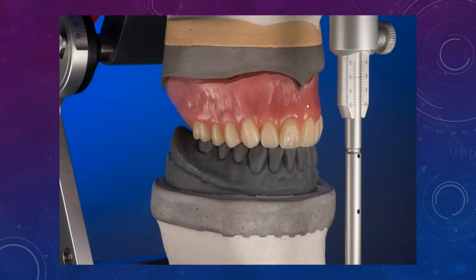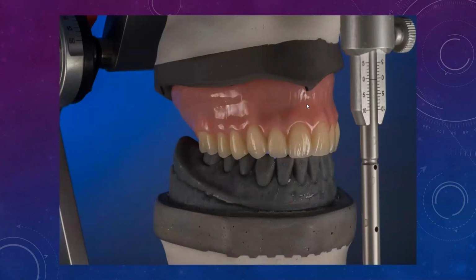Okay, so from there, we're going to do a try-in, make sure everything looks good, and then we fabricate a temporary full denture. Now that can be used for conversion down the line, or if you're me and you want to do things correctly, you're going to have this patient wear this for a while until everything stabilizes, at least a couple of weeks to a month.